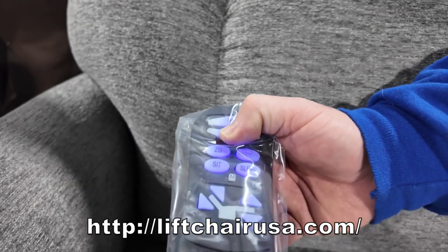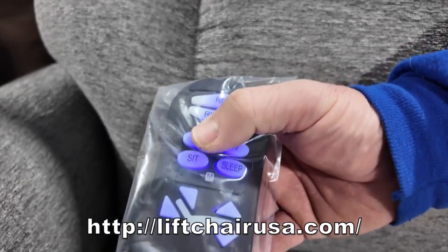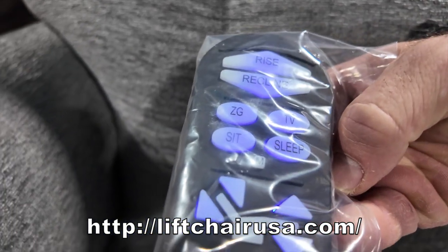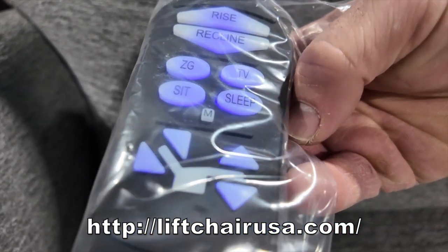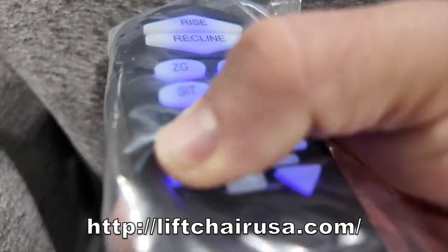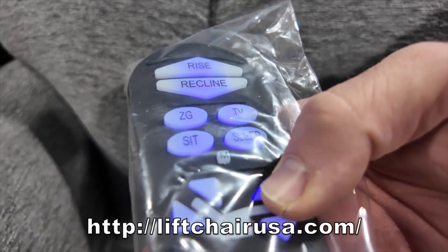This is full control of the chair — this will raise it, this will lower it. Then you have zero gravity, TV, sleep, and sit that are pre-programmed and can be changed to what you like. And then you have your independent adjustment with the back and the feet.